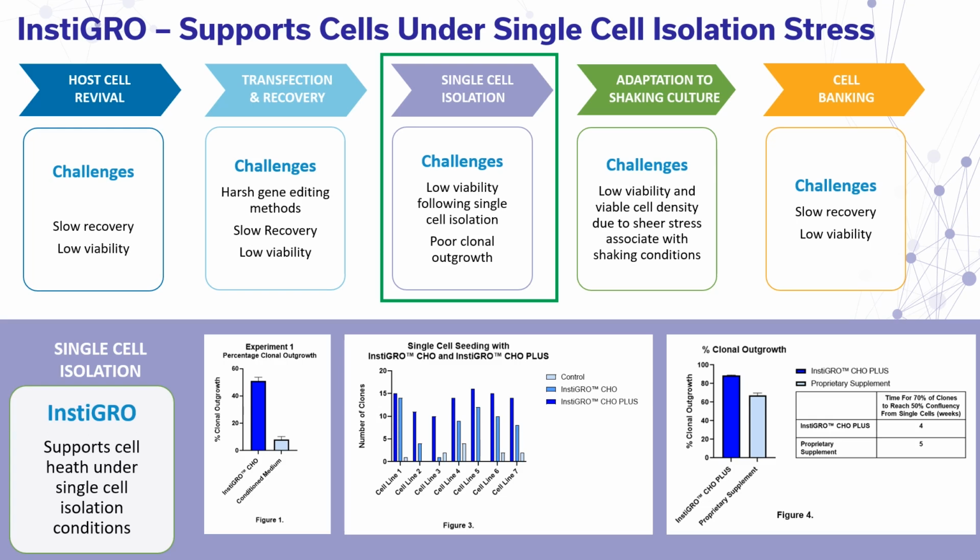In addition to this, today we have also considered conditioned medium. Whilst this is a very low-cost solution to improving clonal outgrowth, it is often subject to batch-to-batch variability, meaning that performance improvement is not guaranteed.